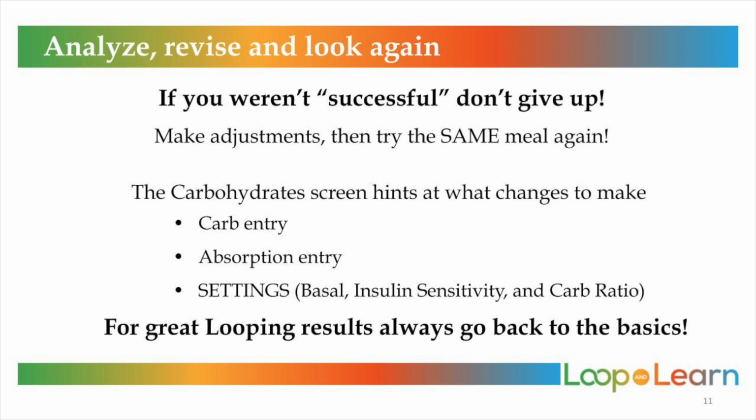If you weren't successful, don't give up. Now that you've found the carbohydrate screen, analyze what needs to be changed for next time. Was it the carb entry time, longer pre-bolus, longer absorption time, something off with your foundation settings? Always return to basics. Repeat your commonly eaten meals until you're happy with the results. You can do it.